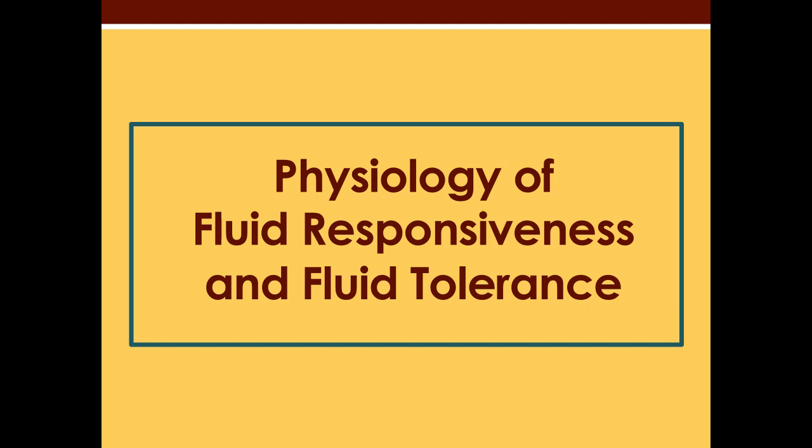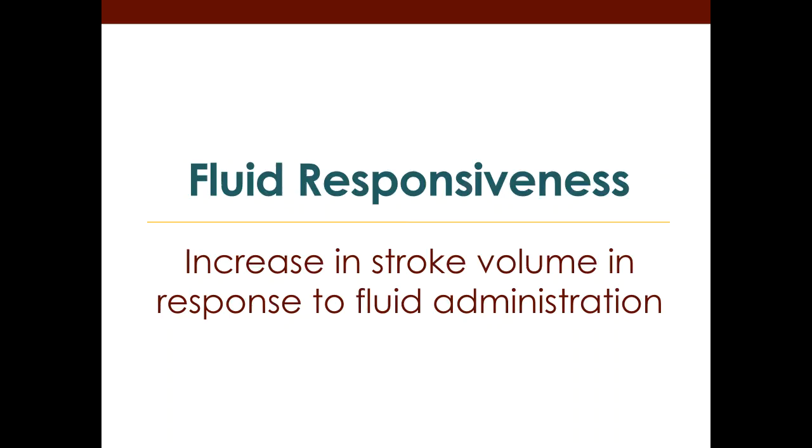First, it's absolutely necessary to understand some key physiology here, because it directly relates to how you're going to use ultrasound to help you answer these questions. So we're going to now spend a little bit of time talking about the physiology of fluid responsiveness and fluid tolerance. Let's start with fluid responsiveness.